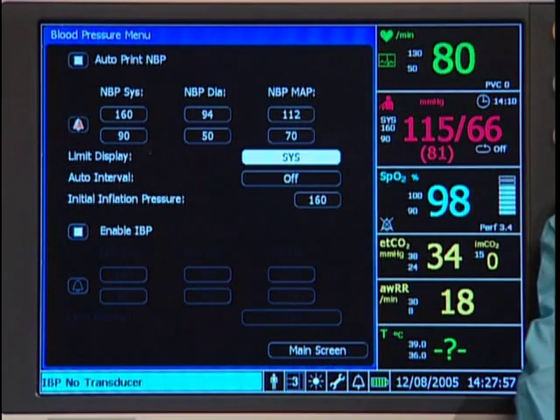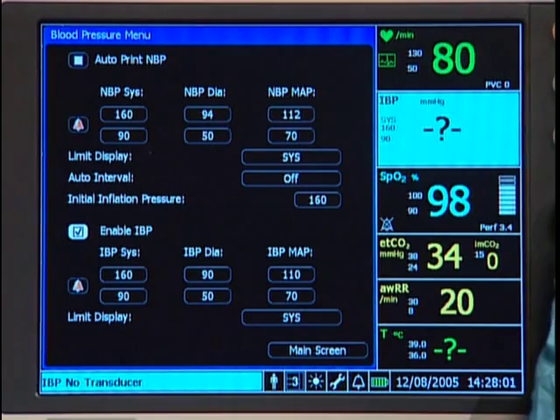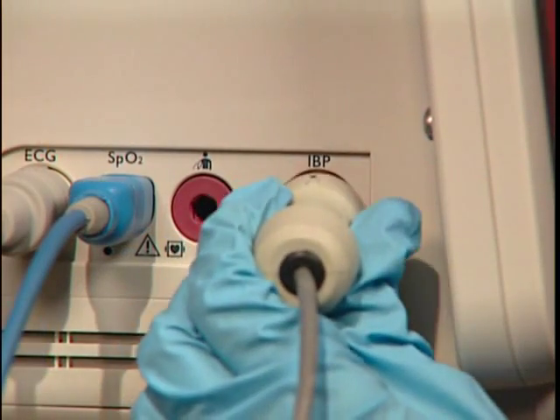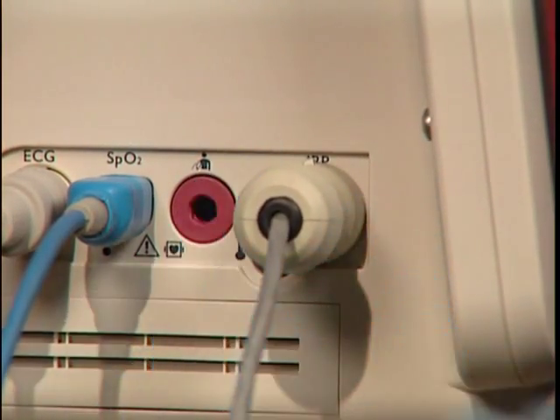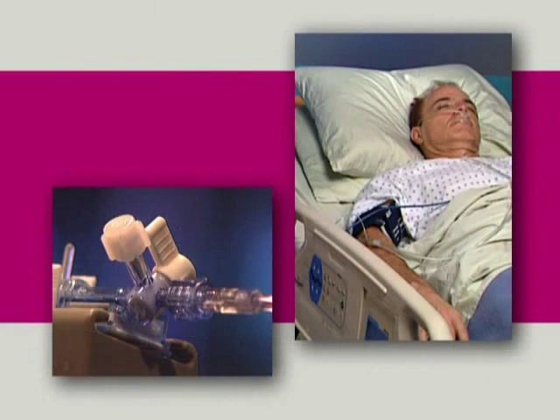Be sure that Enable IBP is checked in the Blood Pressure menu. Connect the pressure cable to the IBP input on the monitor. Prepare a pressure line and level the transducer to the patient according to your institution's guidelines.